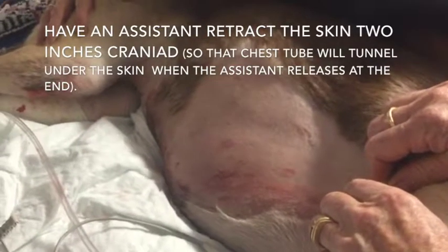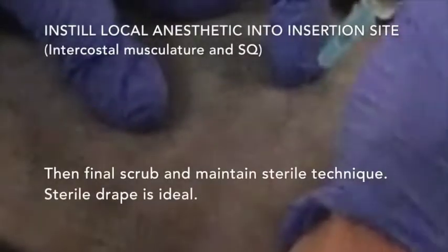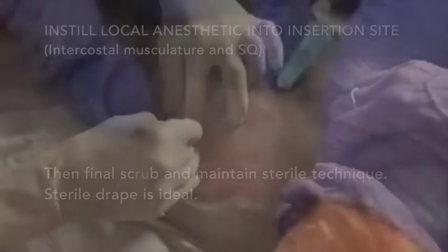Have an assistant retract the skin 2 inches cranially. Then instill local anesthetic. From here you will want to use sterile technique.